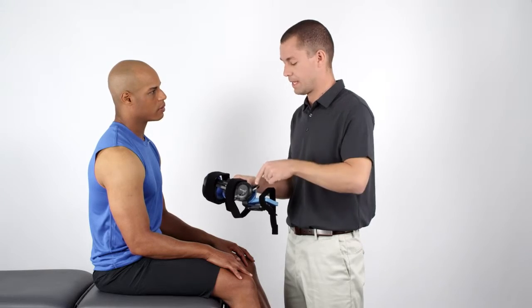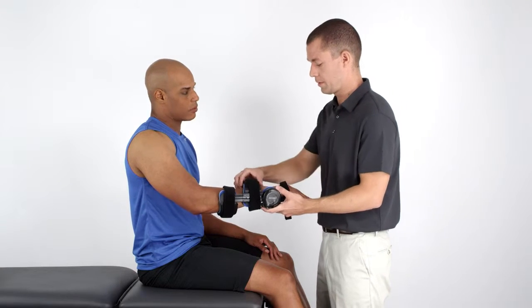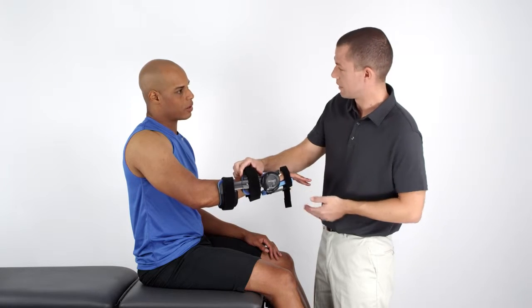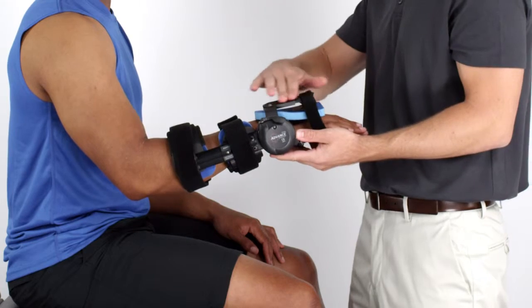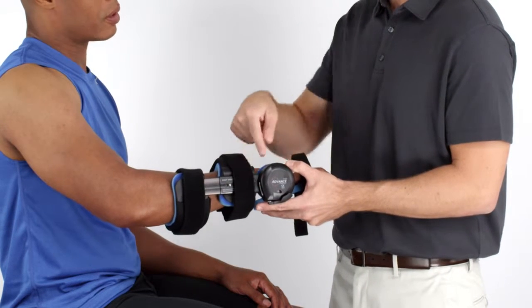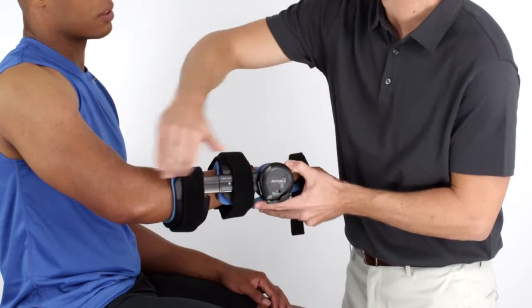With the device locked, you may apply the orthosis to the patient's wrist and forearm by sliding their hand through the molded cuffs. For extension treatment, the palm should rest on top of the palm bar. For flexion treatment, the palm bar should rest on the dorsal knuckles. Align the device so the center of the tension spring cover lines up with the joint axis of the wrist. Then align the struts by following the long bones of the arm.